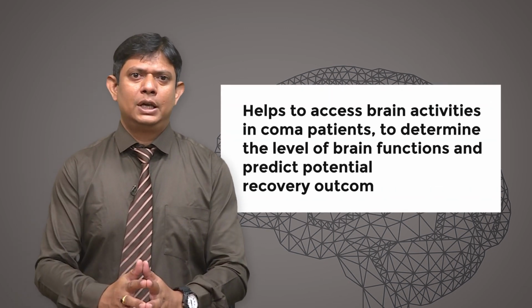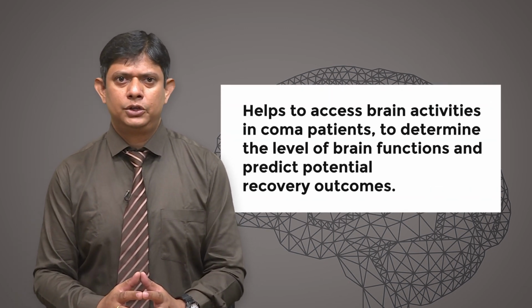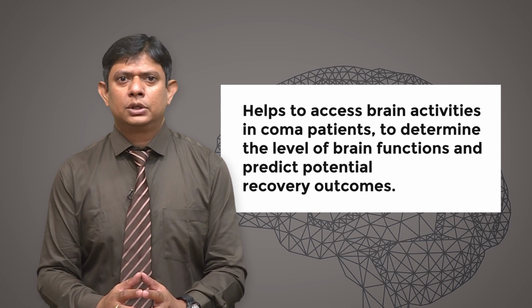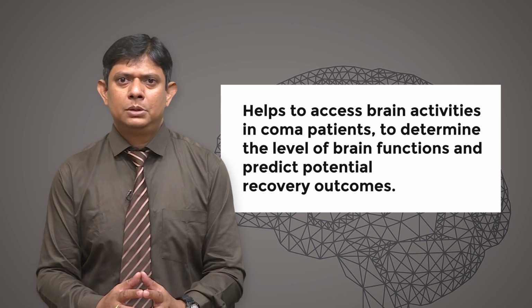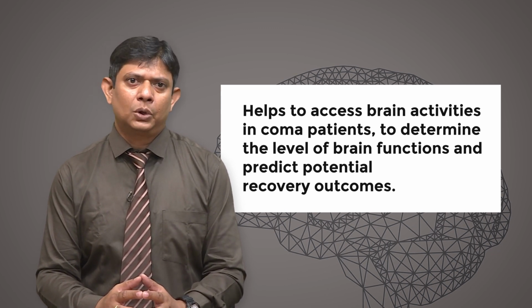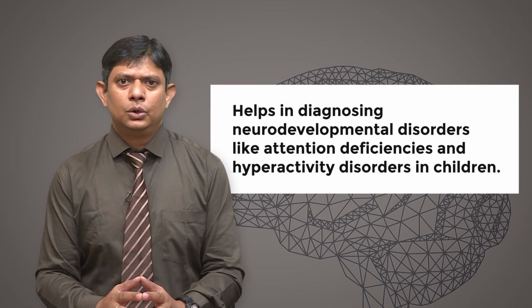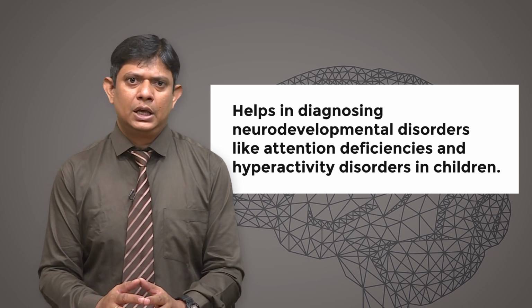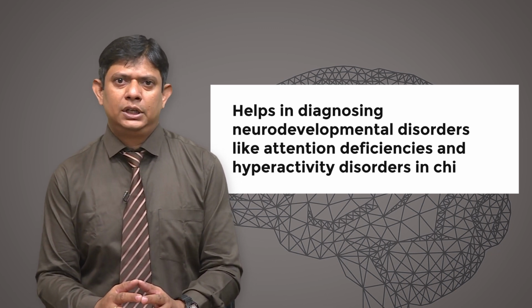Coma assessment. EEG is used to assess brain activities in patients with altered consciousness, such as those in a coma. It helps determine the level of brain function and predict potential recovery outcomes. In neurodevelopmental disorders in children, EEG aids in diagnosing neurodevelopmental disorders like attention deficit hyperactivity disorder.